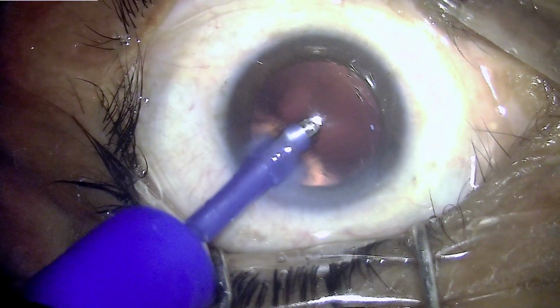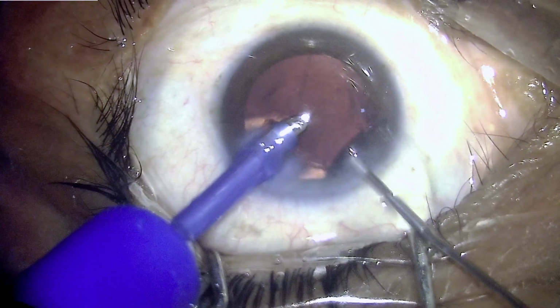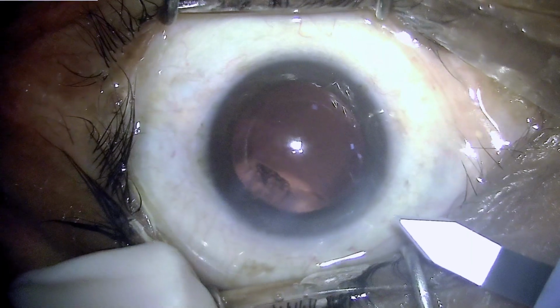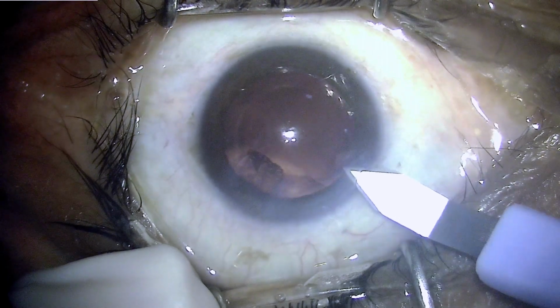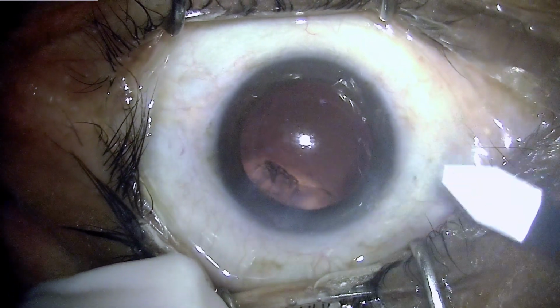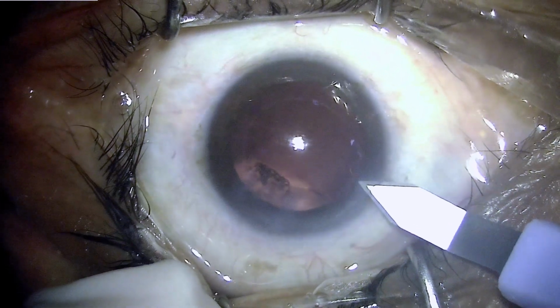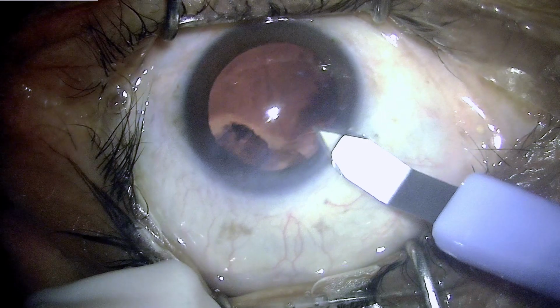At this point, I had thought of giving up that portion so that it can be extracted later on, inflating the anterior chamber with viscoelastic and moving on to enlarging the side port so as to accommodate my Simcoe cannula, which can be used if the wound is designed in such a fashion that it tightly fits the incision. It will behave just like your phaco handpiece and IA tip.